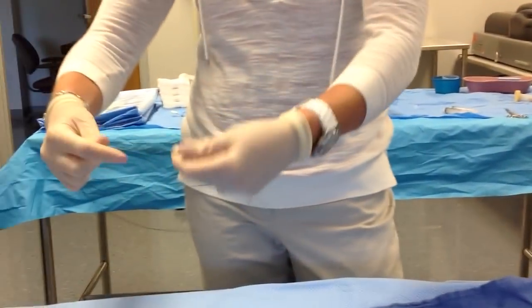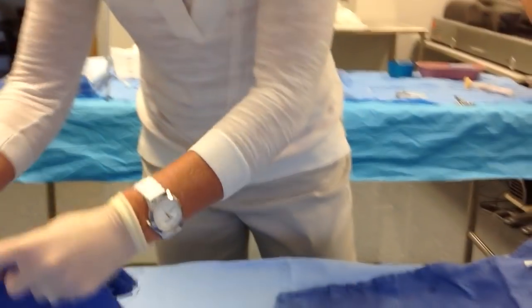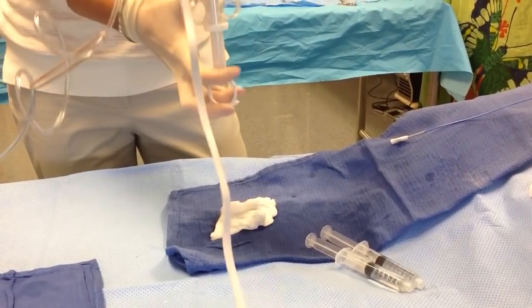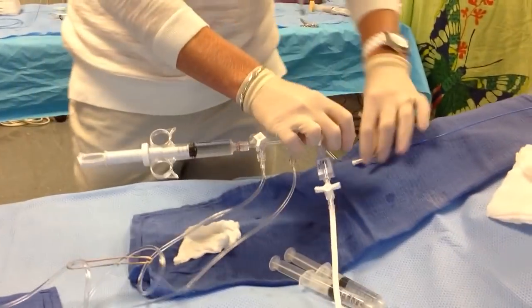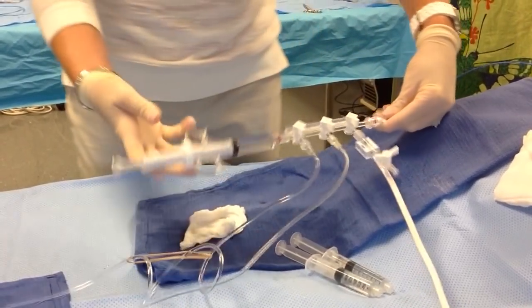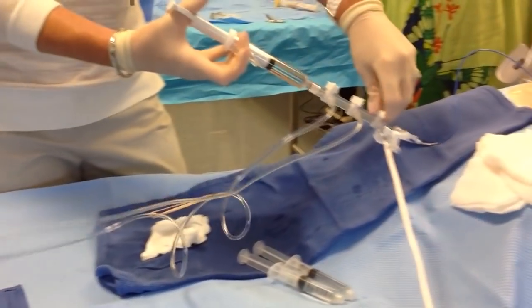This wire is all goofy. Okay, so I'm going to get some flush. I'm going to get that air out. Connect here. And what do we do first? Check pressures. We check pressure, and it's still going to be AO pressure.